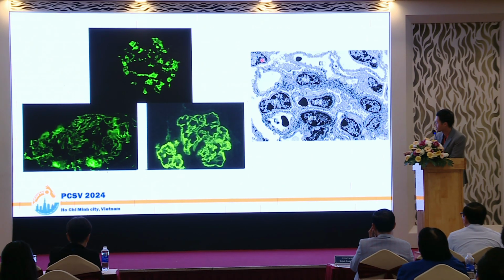Using immunofluorescence, we can identify the deposition of immunoglobulin or complement. Using EM, we can closely look into the structure and see if they are okay.